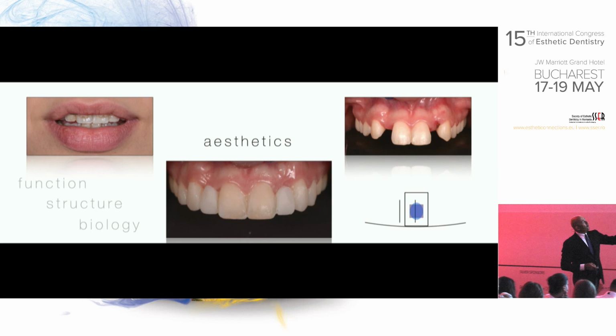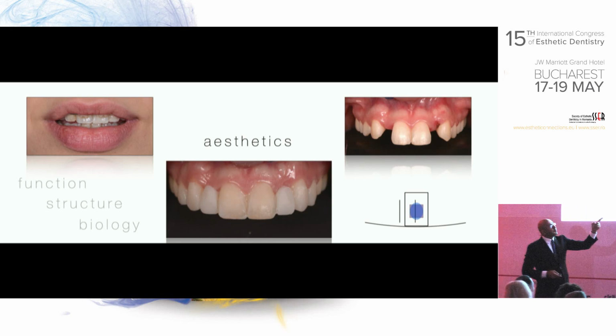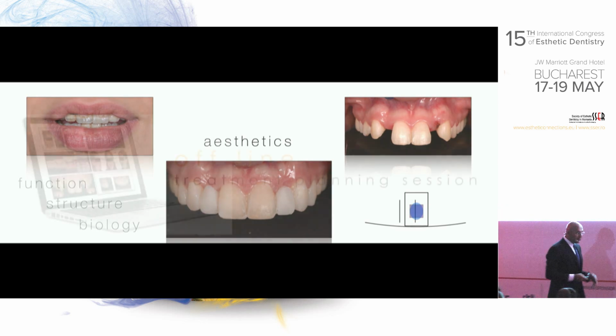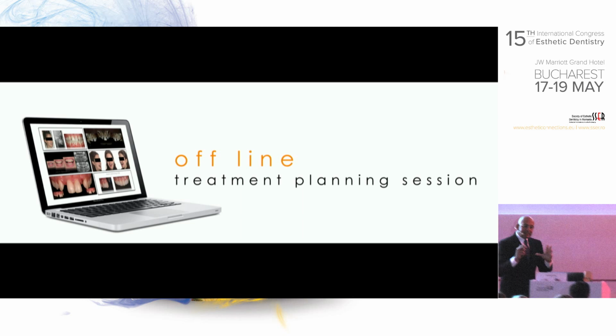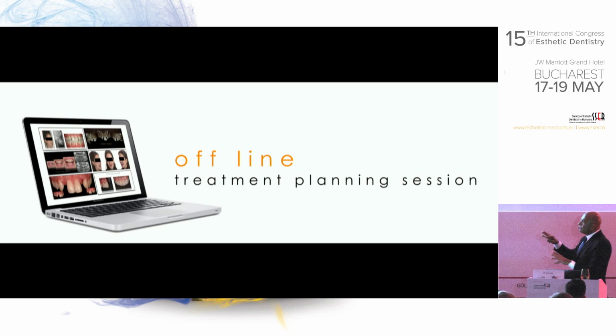So this is what we do, starting with the mock-up on your left, taking the braces out, and then applying the direct mock-up with this Visage Smile design.